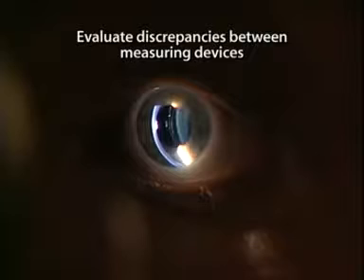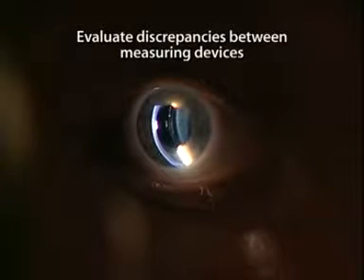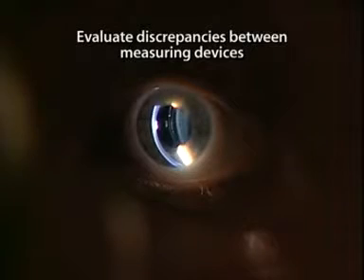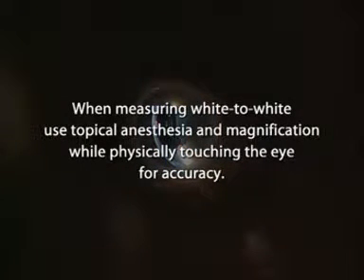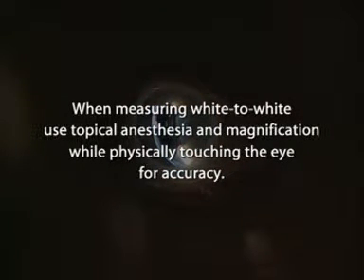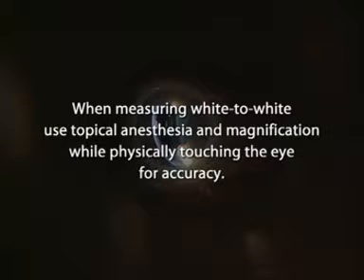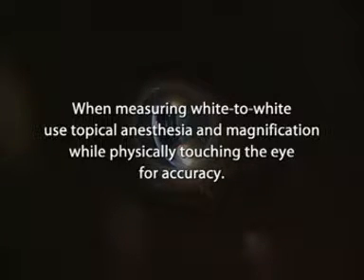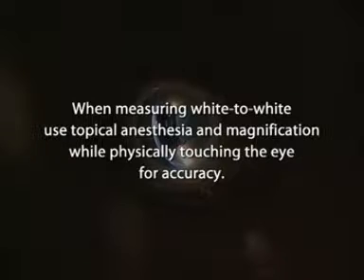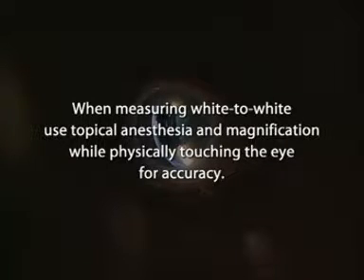Evaluate any discrepancies between measuring devices. Sometimes a pterygium or other anomaly can cause a discrepancy, as can improperly calibrated calipers. When measuring white to white, use topical anesthesia and magnification while physically touching the eye for accuracy. Remember, the ICL is not recommended with an ACD of less than 3 millimeters.